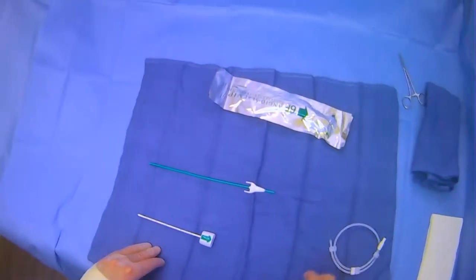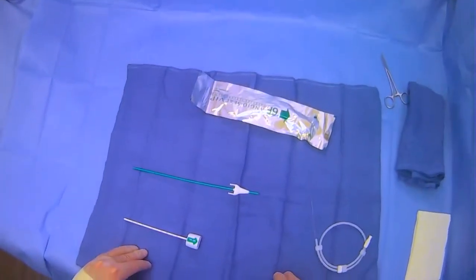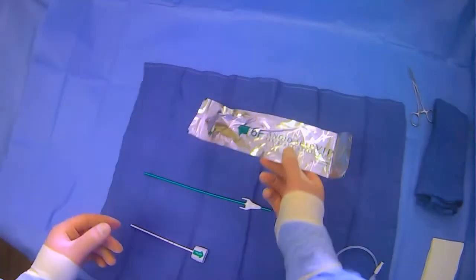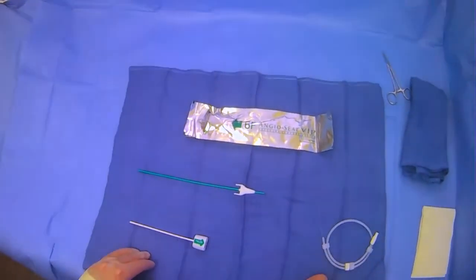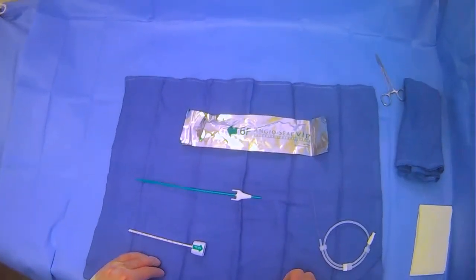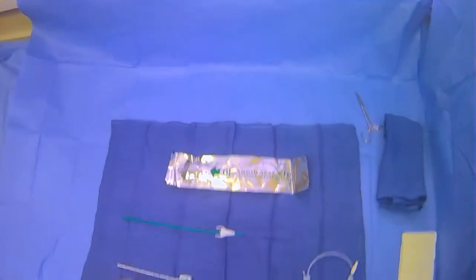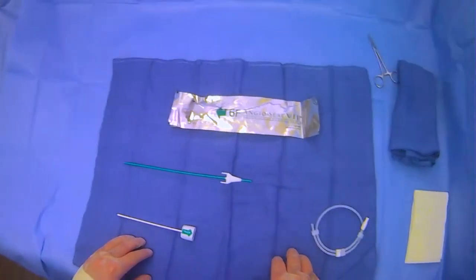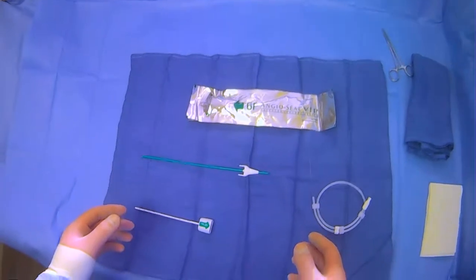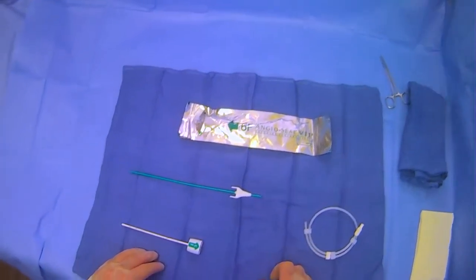We're going to be going over what is included in the AngioSeal kit. This is a device made by Terumo. It is a closure device used at the end of a case, oftentimes when you have gotten femoral artery access, to stop bleeding and avoid having to apply manual compression. There are a few different versions, but most are relatively similar. The one we commonly use is the traditional AngioSeal kit.